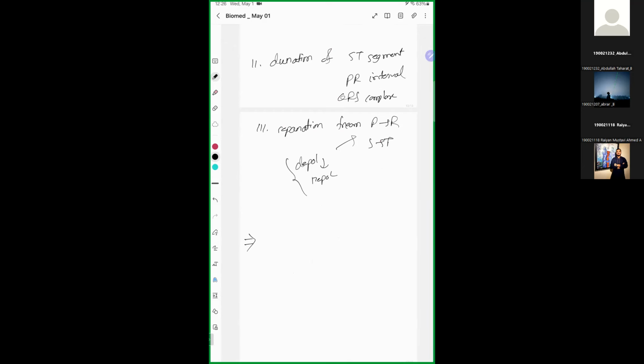In terms of frequency domain, one of the issues with frequency, like I mentioned, is too fast a readout. That is called fibrillation. There are different types of fibrillation; we'll discuss them a little bit later. One type is called atrial fibrillation, AF. When the heart beats too fast, this kind of fibrillation is one of the issues that can cause serious damage. So you can measure this kind of thing from the frequency domain analysis, as I already mentioned.